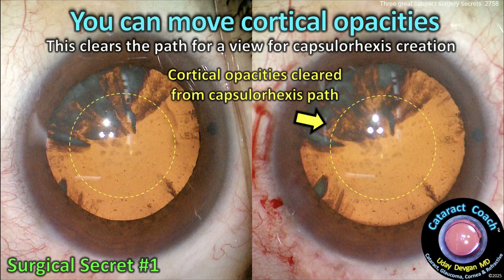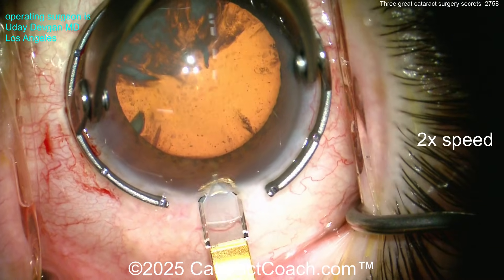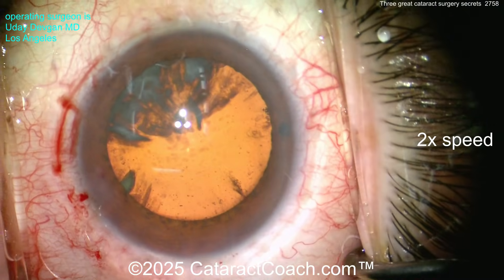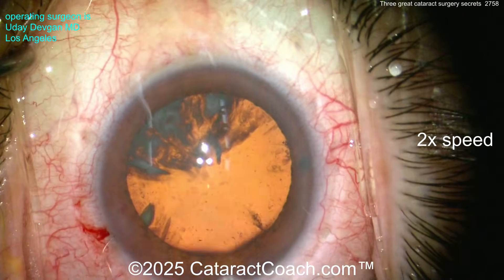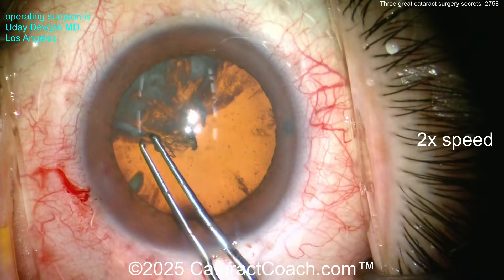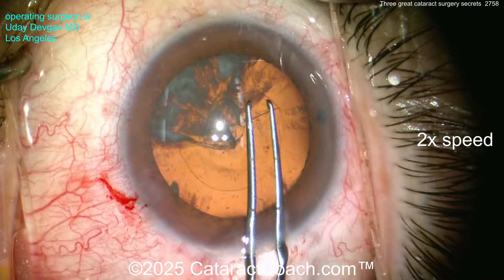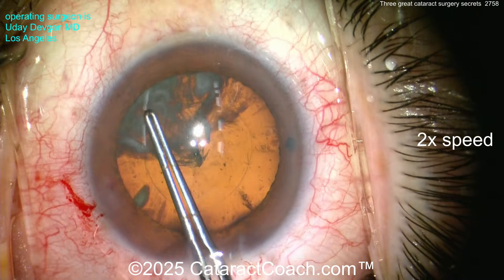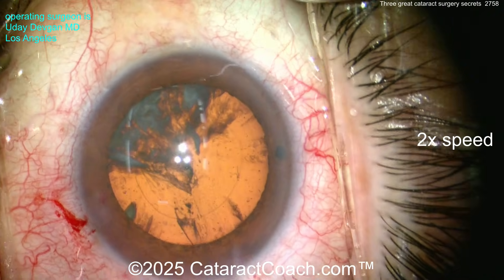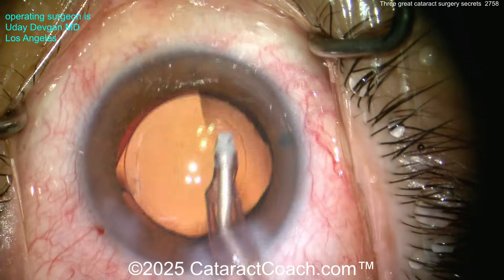You can clear this path for capsulorrhexis creation. Here's a before and after — you can see it makes a difference. Now as we do the rexis, it's going to be easy because the path for that five or five-and-a-half millimeter capsulorrhexis is totally clear. There's the diamond going in making about a 2.4 millimeter incision, using a 2.0 diamond. Here come my forceps — measuring out, starting the rexis — nice and easy. Measure again just to be sure, and we complete a beautiful five millimeter rexis, visualizing it right through that area of cortical clearing.